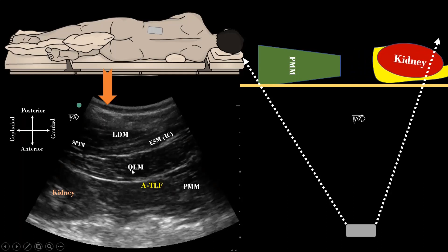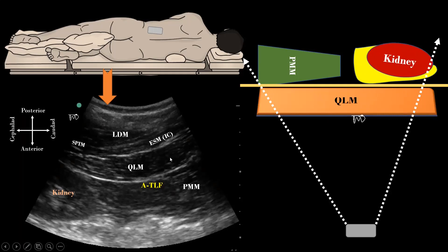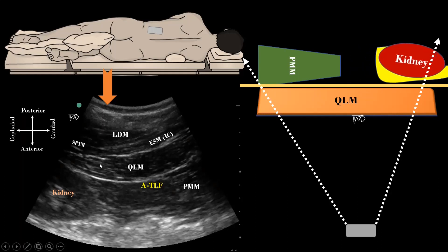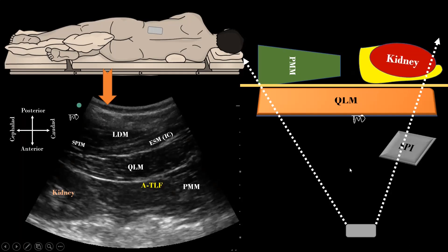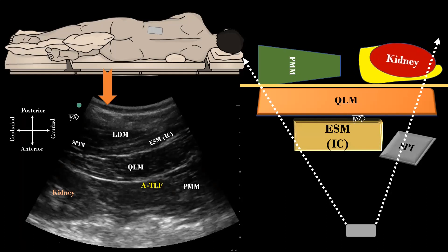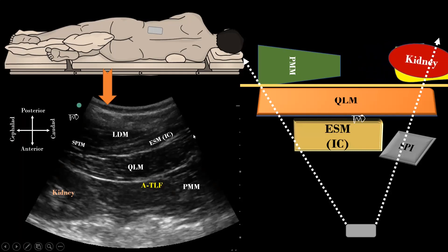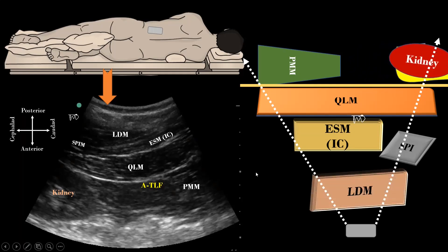The hypoechoic muscle just behind the anterior layer of the thoracolumbar fascia is the QL muscle. It tapers and thins cranially before its insertion into the lower border of the 12th rib. Posterior to the QL, a bit of serratus posterior inferior muscle and a thin layer of iliocostalis muscle from the erector spinae group or paraspinal muscles are visible. The third layer is formed by the latissimus dorsi muscle, which is the most superficial one.